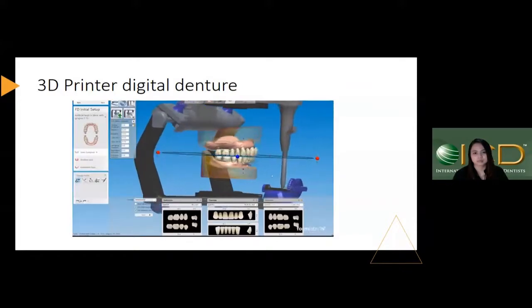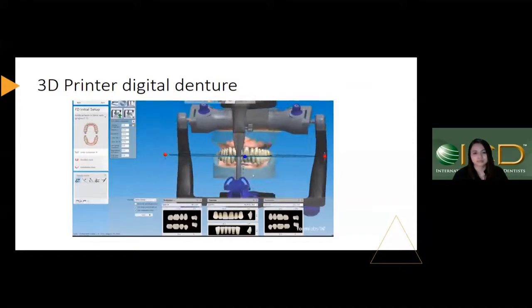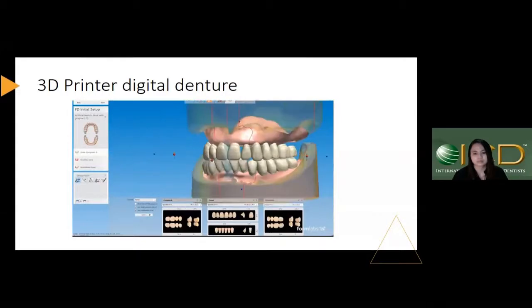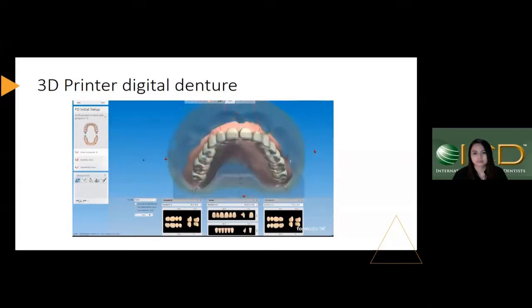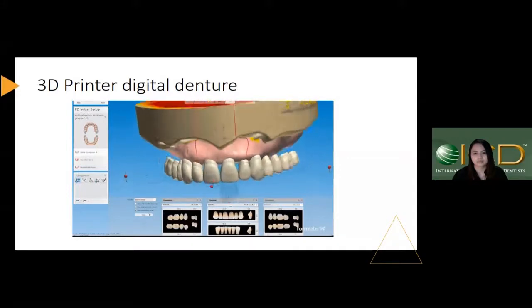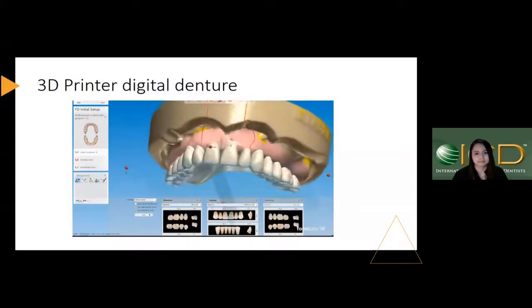In our testing so far, we've only found a few open teeth libraries, but there are also a few that are closed. The closed libraries only allow certain manufacturing methods. It's very important to test and try the dental CAD software that you will be using for digital dentures. That way you can discover which libraries are open and closed so you can fit it best to your dental business.